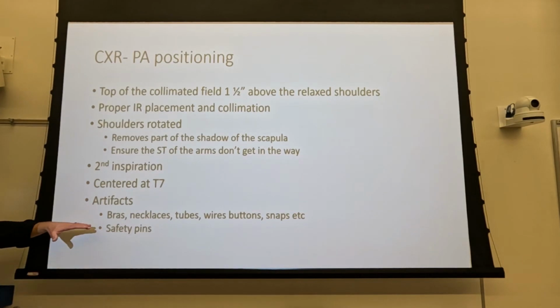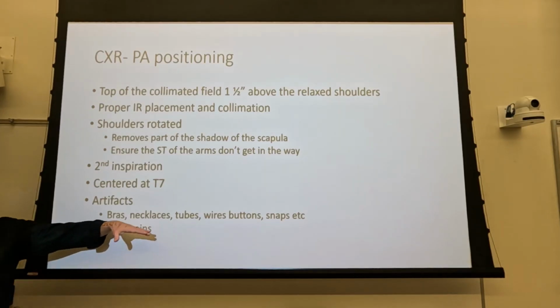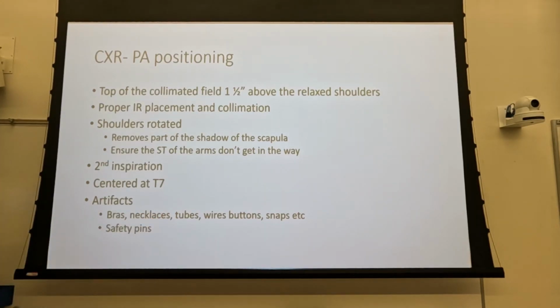And you can do some of this without even asking, because some of your patients lie to you. You have a bra on? Yeah. No or no. And while you're positioning, you just feel for bra straps. You've got a bra on. Bra's got to come off. So you frisk them, you look, you ask, all that stuff.